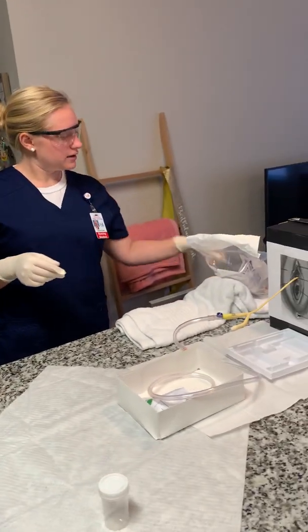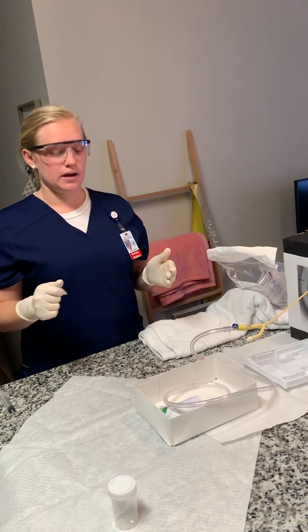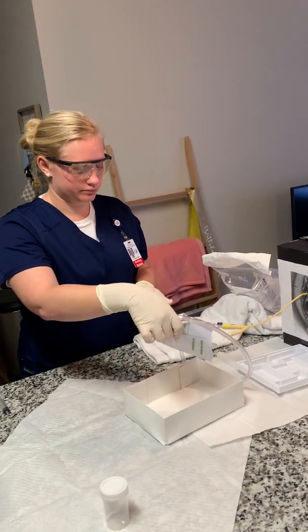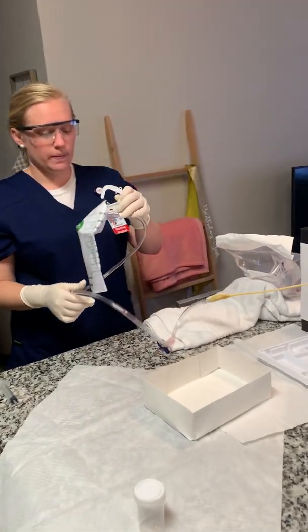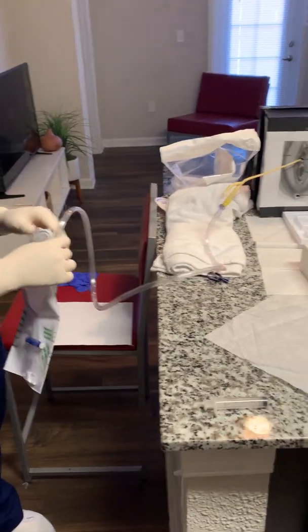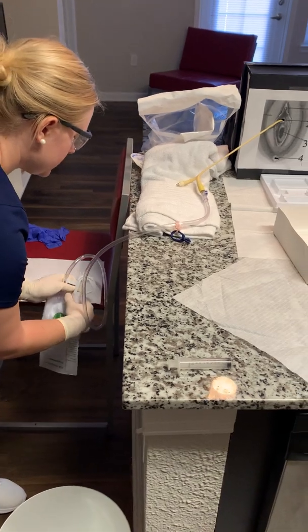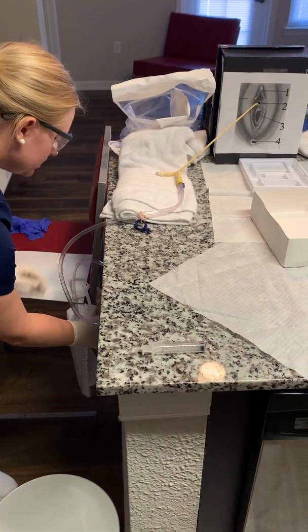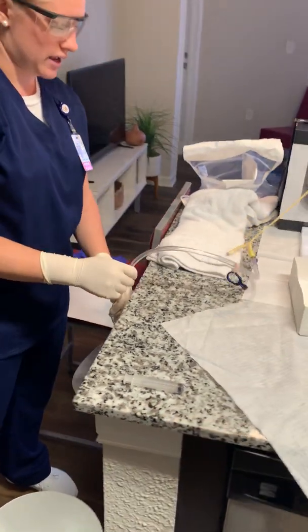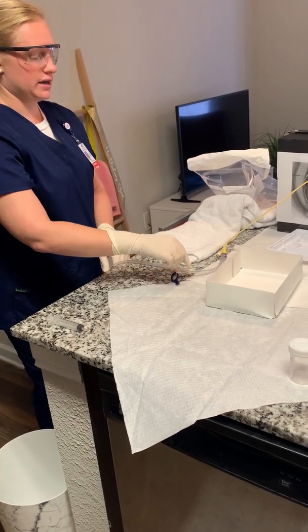Okay, so now that's how you place a stat lock. So I'm just going to put that there. Okay, so now after my stat lock's in place, I can hang my bag. So I'm going to take my bag and hang it on the bed frame, not the bed rail. I'm going to hang it on my chair just for right now. I want to make sure it's below the bladder and that the loops are straight. And there is also a little clip that I could clip it on the bed with.